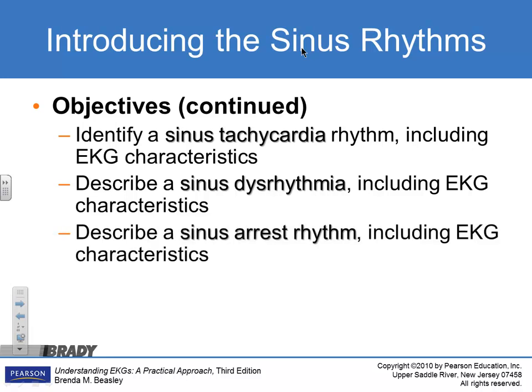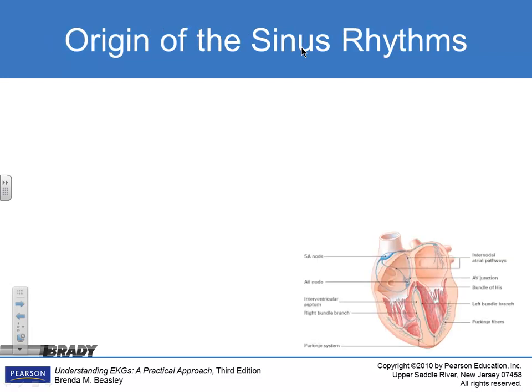Anyway, and we're going to look at sinus arrest and the clinical significance of these. And one thing I'm sure Nick's already talked about, we're going to be treating your patient, not the monitor. So you may see something weird on your monitor. If your patient is alert and oriented, vital signs within normal limits, don't be freaked out. So we're treating your patient and not your monitor.